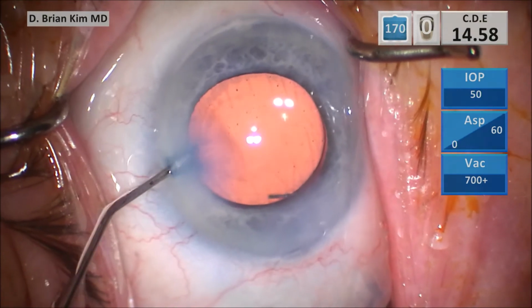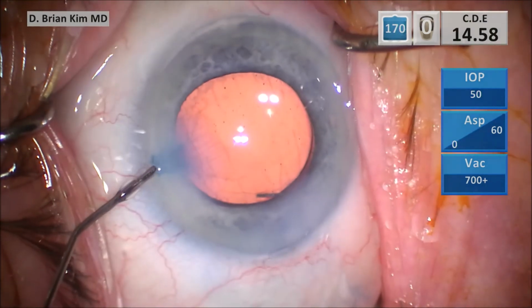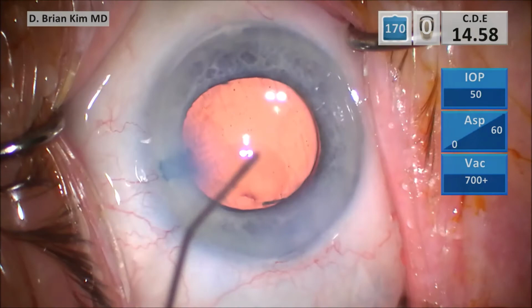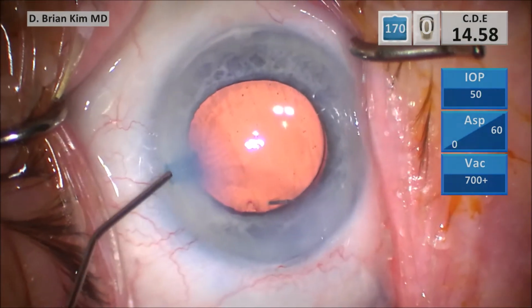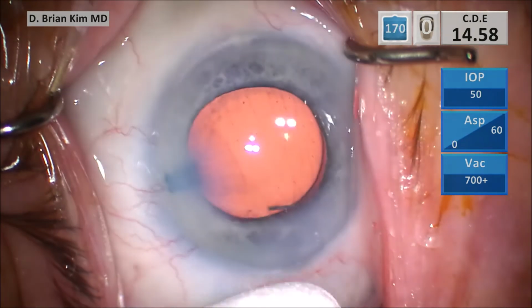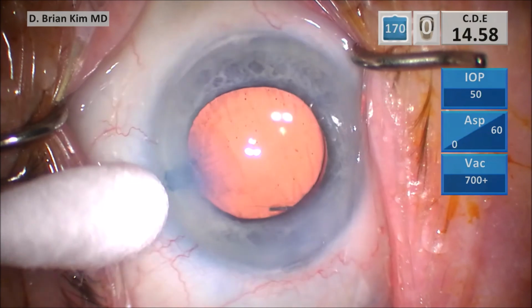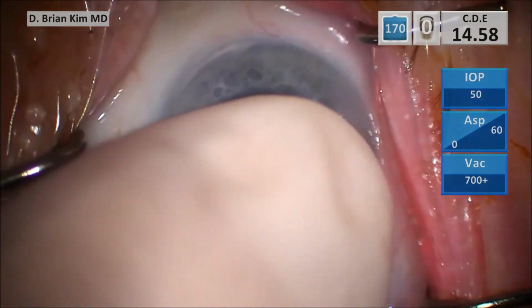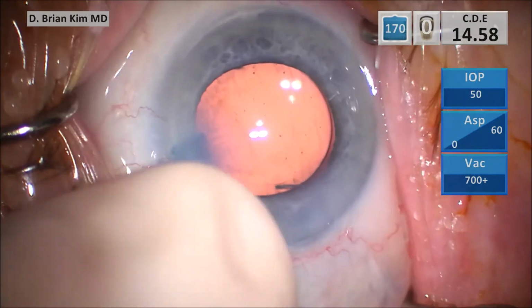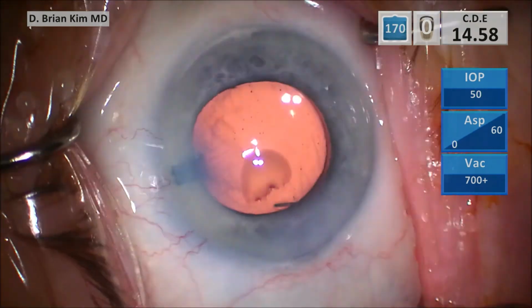There's minimal endothelial cell damage when you use less ultrasonic energy. I'm effectively able to avoid getting corneal wound burns with these dense lenses and also avoid the post-occlusion surge because I'm never using super high vacuum when I have occlusion. I'm fracturing the lens into smaller and smaller pieces and then pulsing and feathering my pedal. So I never get high vacuum, therefore I never get post-occlusion surge, and therefore the risk of posterior capsule rupture is much lower. This is a much more controlled, methodical, systematic way to disassemble the lens.